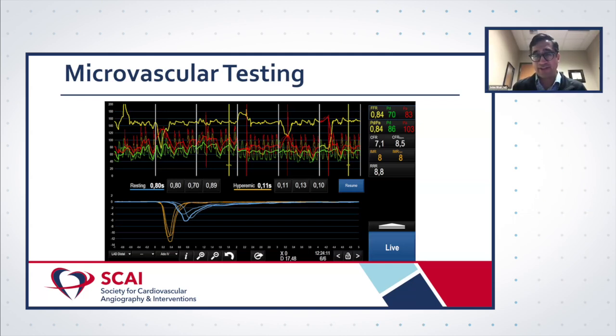I just want to observe there is a disconnect here because the usual thought is that if you have epicardial disease, you probably also have microvascular disease of a similar type, specifically increased resistance in the microvasculature due to atherosclerotic disease that's diffused through the entire coronary tree. But here we're just not seeing that, and every once in a while we get a case like this. I don't know if it's an error in measurement. I don't think it is because these are pretty good curves, and if anything, the other thing that we check is whether there is an epicardial lesion that is somehow explaining a low CFR. And here we even have an FFR, if you look at the upper right-hand corner, of 0.84. It's not ischemic, but there is reduction in pressure across that vessel. But even with that, we still have a super normal CFR.